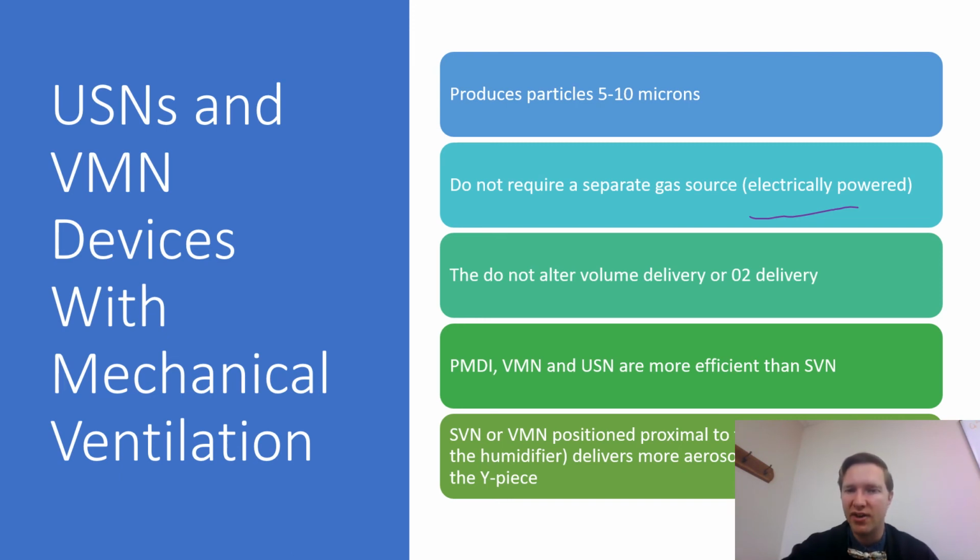They do not alter the tidal volume delivery or the oxygen concentration, right? They don't alter your FiO2s. They don't make your tidal volumes big, right? So you don't have to worry about that component at all.